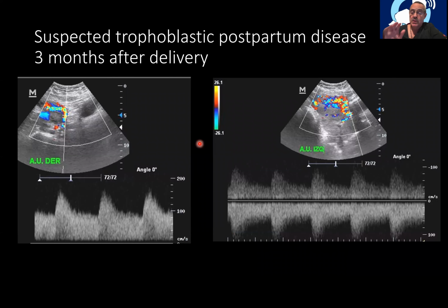but I wonder why the uterine arteries three months after delivering a baby still have low resistance. This is usually the pattern of blood flow during pregnancy, if normal, not if high risk of preeclampsia. This doesn't even have a notch. This is very normal for a pregnant uterus, but not for after three months of delivering a baby.